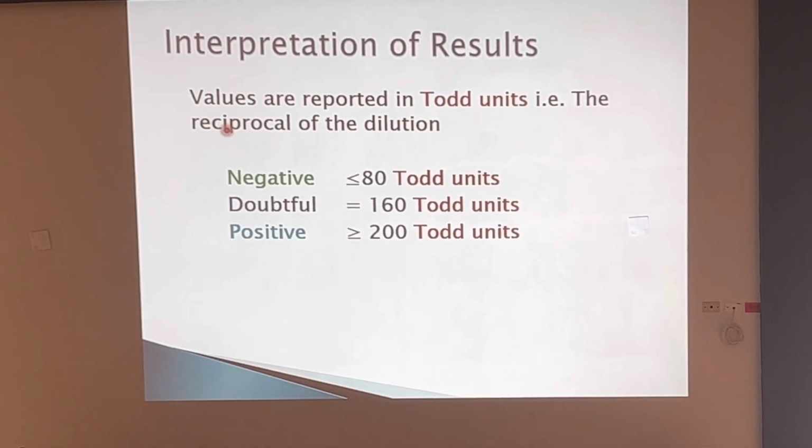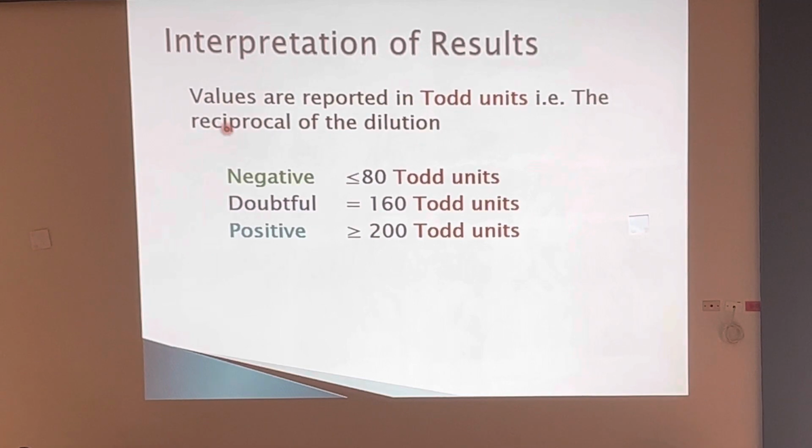All right. So how do we interpret your ASO test now? We have all these results. We need to know whether or not the results are positive.